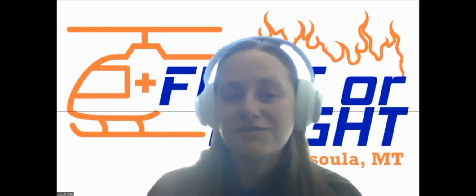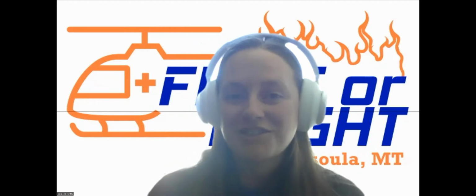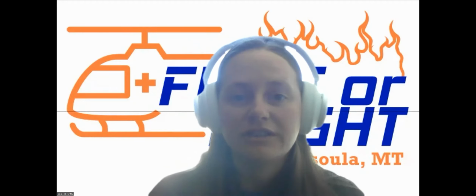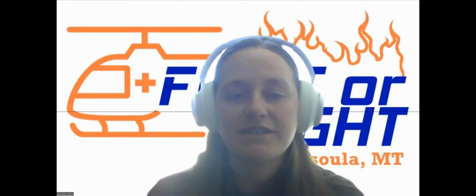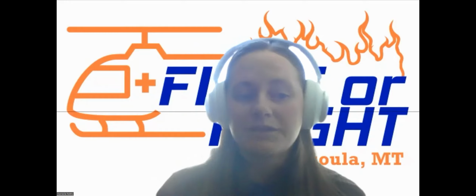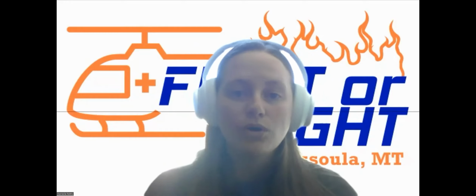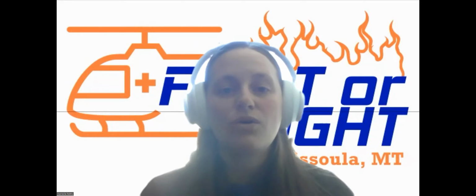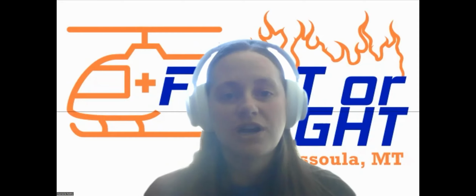So you really want to use caution with that. I shouldn't even say use caution. By using caution, what I mean is do not use the pediatric pads on an adult. It's not enough to restart their heart. You're wasting time. You could be doing high quality CPR. Now, the flip side is okay. If you only have adult pads and you have a child or an infant patient, it's okay to use those adult pads on the child or infant.